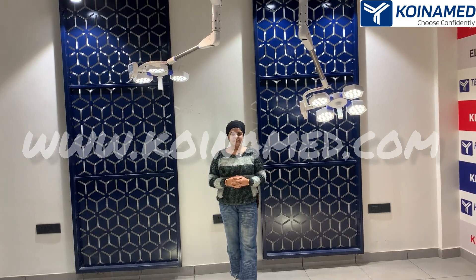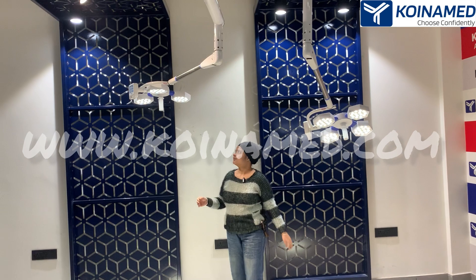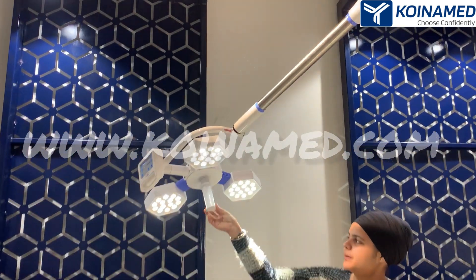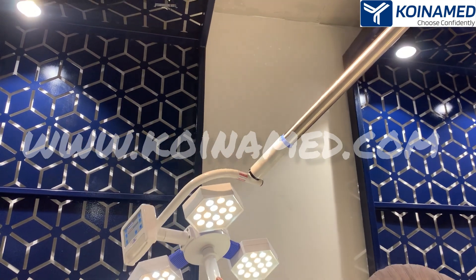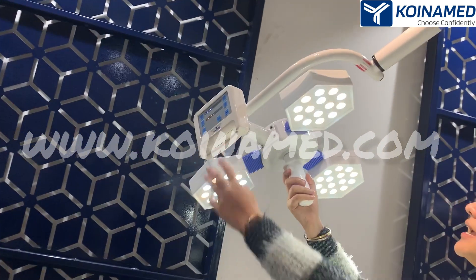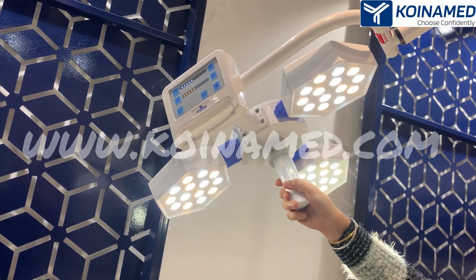This double dome is from the 14 LED series. This is the Hex CT 3, having 3 fins. Here we have provided the combination of white and yellow LEDs. In the middle we have provided the sterilizable handle for adjusting the focus.